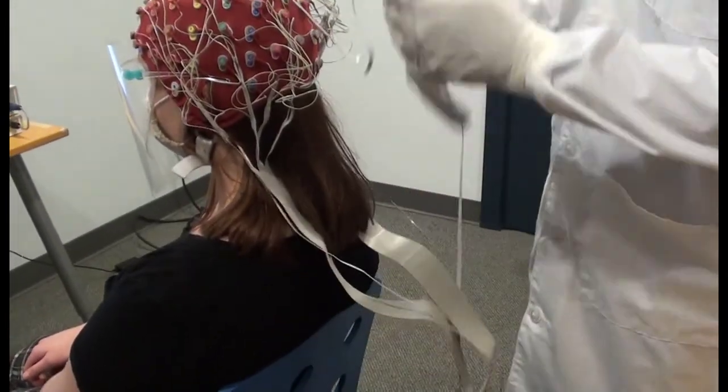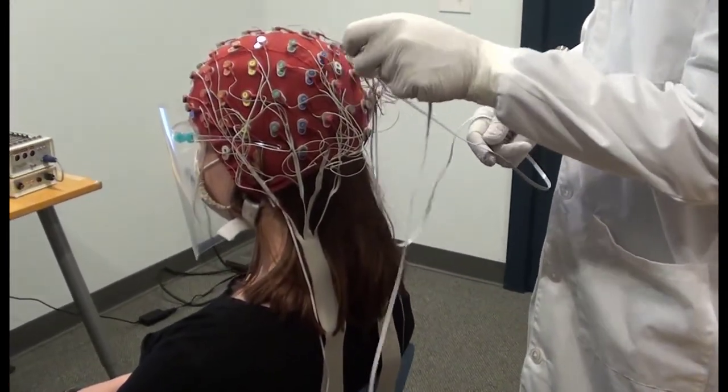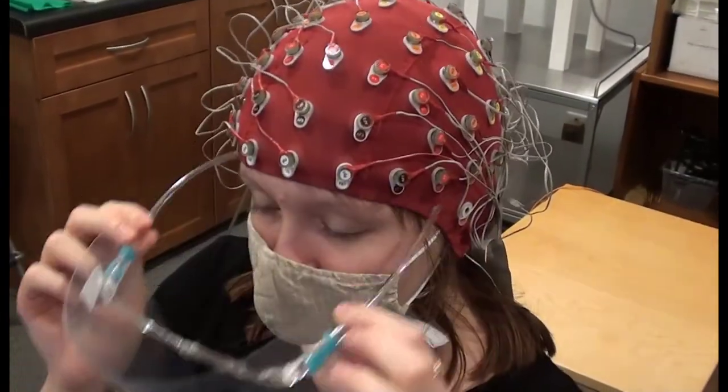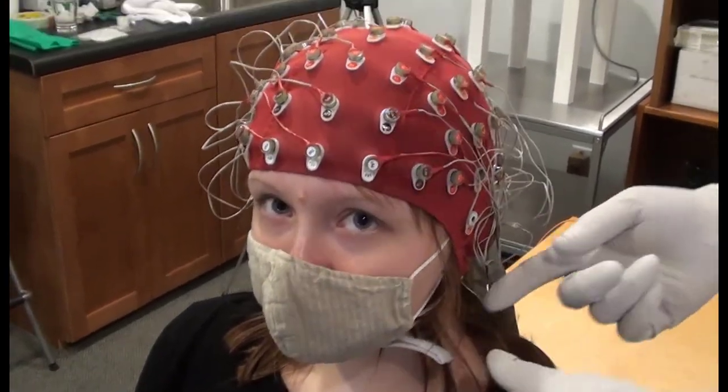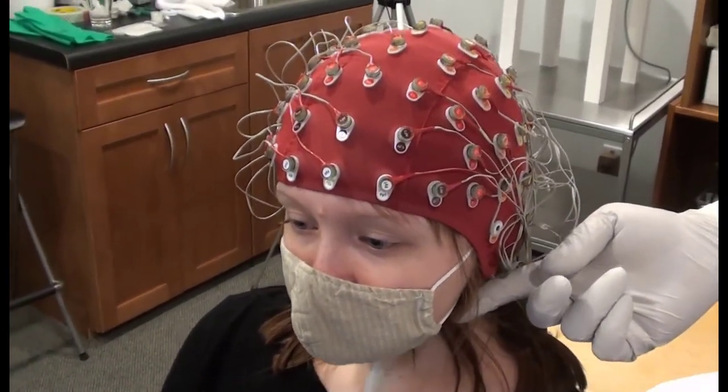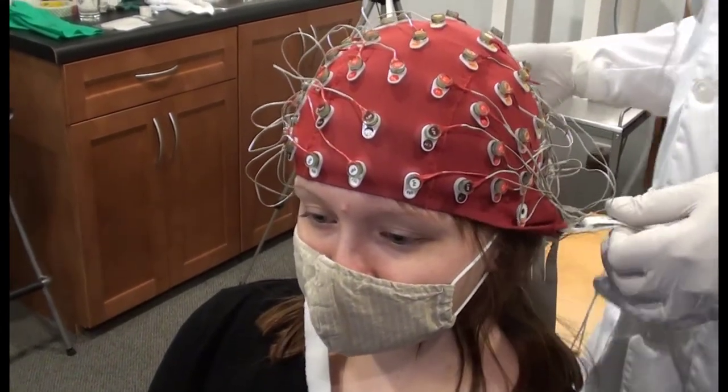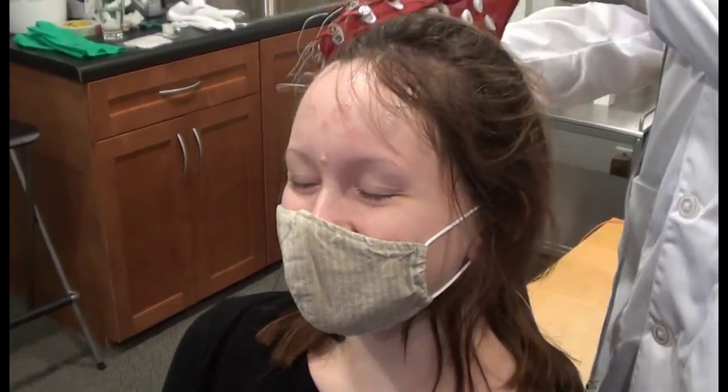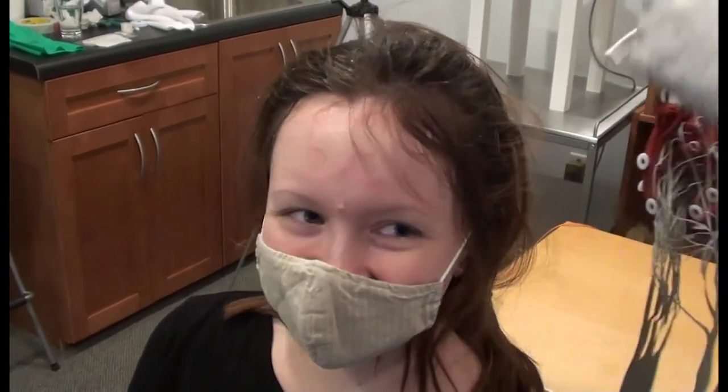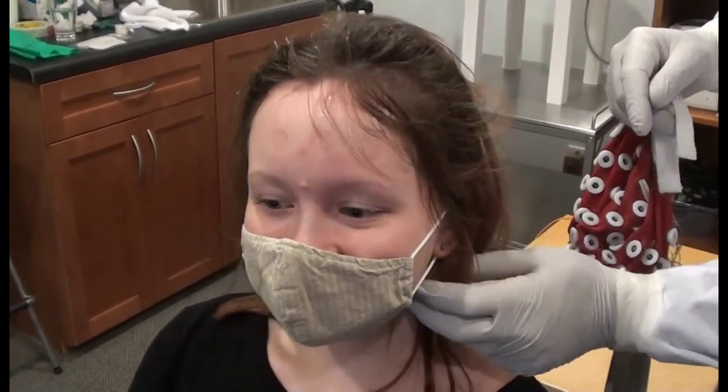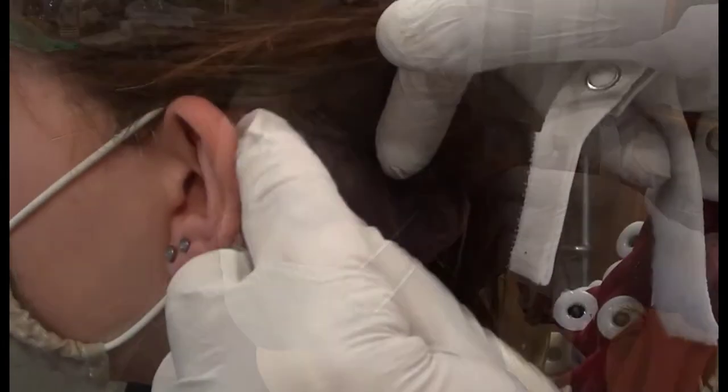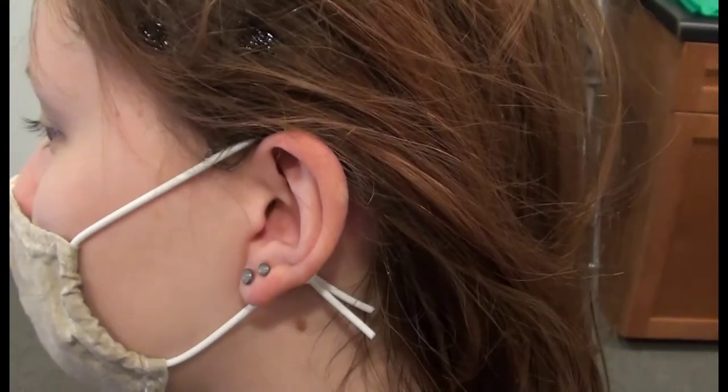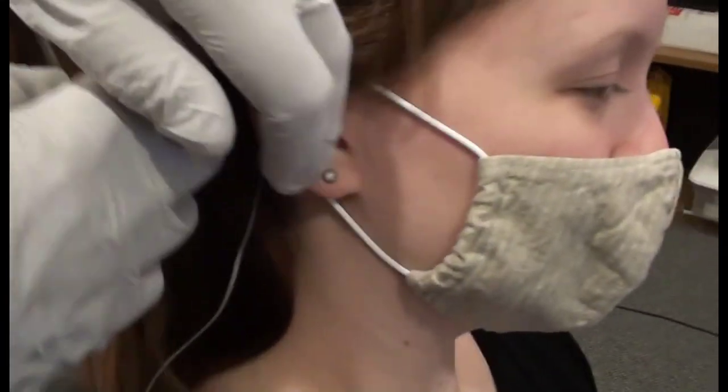Pull the CMS DRL cable upward gently to free it from the rest of the cables and then remove CMS and DRL from the head cap. Ask the participant to remove the face shield and then unfasten the chin strap. Grasp the two sides of the chin strap and pull upward to remove the assembled cap from the participant's head. Remember that the mastoid electrodes are still attached to the participant, but since you removed the CMS DRL cable from around the rest of the cables, the cap and ribbon cables should come off cleanly without being tangled in the EXG cables. While holding the cap in one hand or hanging the assembled cap and electrodes around your neck, carefully remove the EXG electrodes at mastoids earlobes and around the eyes if you recorded EOG.